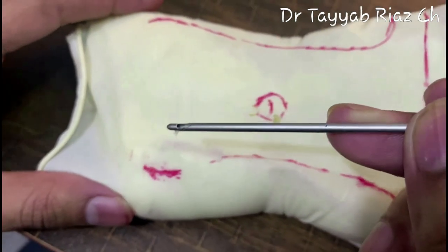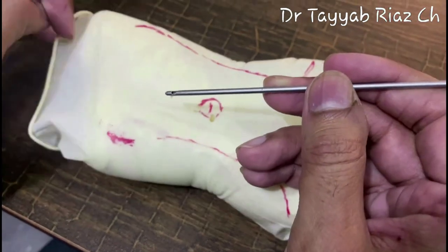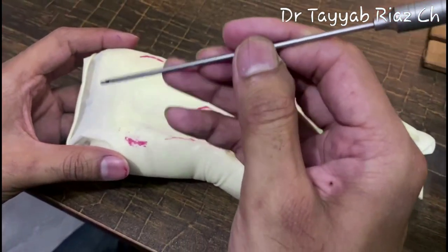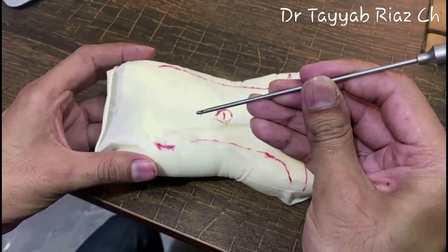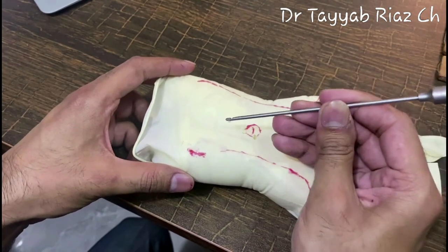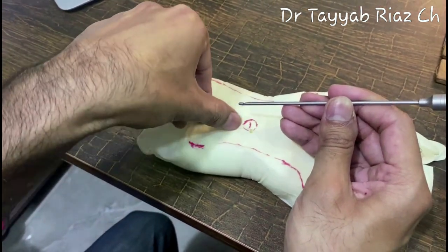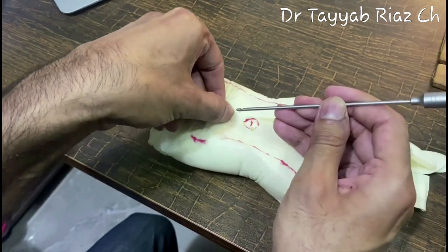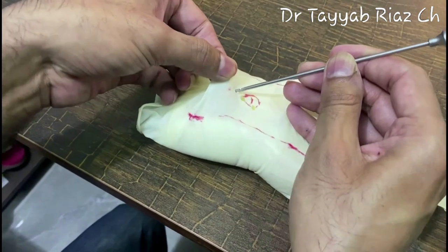And after measuring this distance from the tip of the needle, you should hold it like a dart to make the 45 degrees angle. Why? That I previously told, so that it should not enter vertically. And after that, you should grasp the whole anterior abdominal wall thickness, not only the skin, to make the 90 degrees angle with the anterior abdominal wall.